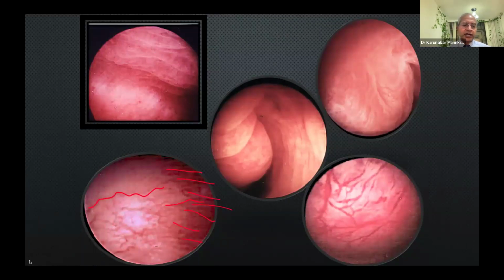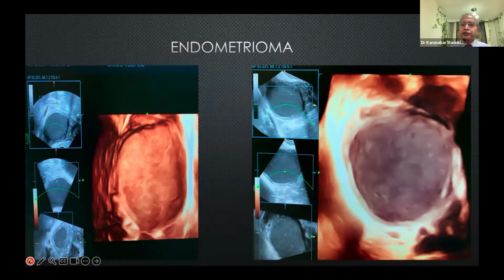That's why I wanted to add on, just diagnosing fibroid on ultrasound and jumping around with different protocols is not what matters. The patient should benefit from your knowledge and skill. So let's talk about endometrioma. Obviously, you don't need 3D for that. Most of the time you can diagnose it, but I wanted to note that maybe 30-40% of endometriosis is endometriomas. Everything else is in the pelvis or adenomyosis.